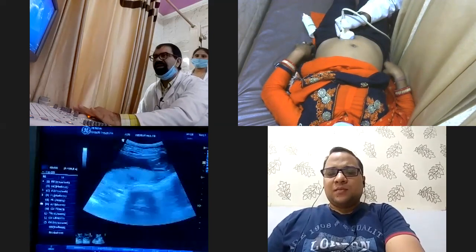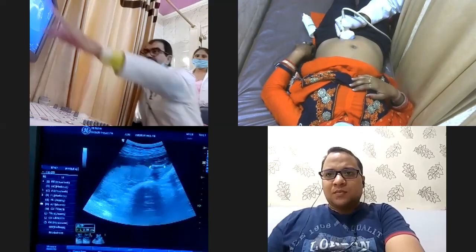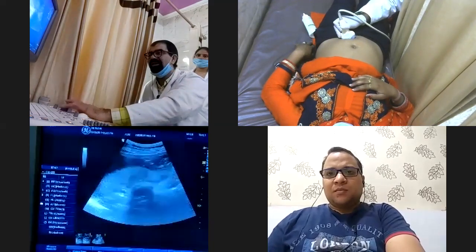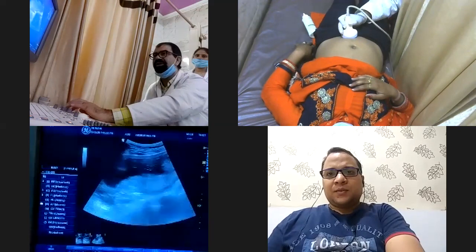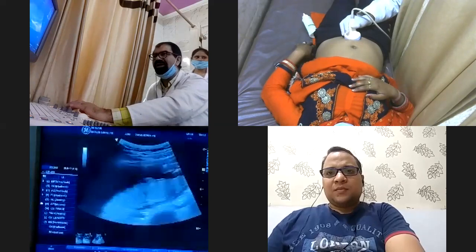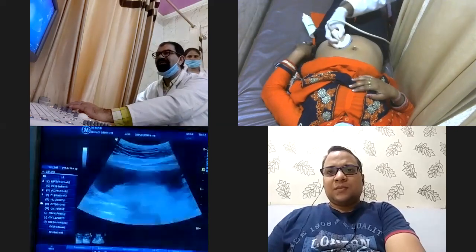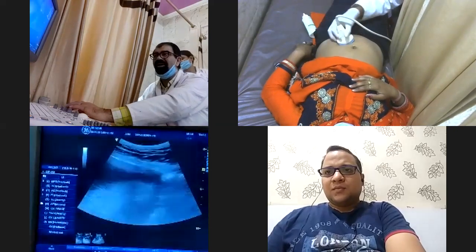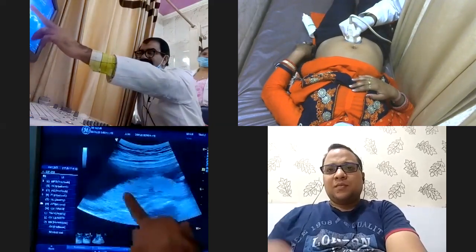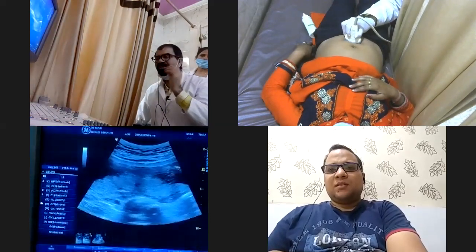You will tell me where this placenta is. Is that on the anterior or on the posterior? Now see, this is the placenta over here. Even if you are not doing ultrasound, now see the beauty of knowing the basic things. Even if you have no idea of anything, but if you are clear with the physics and the machine settings, if you are clear with what you are doing, you can make out that this is the placenta, and whether this placenta is anterior or posterior. This is my promise that you can make out.